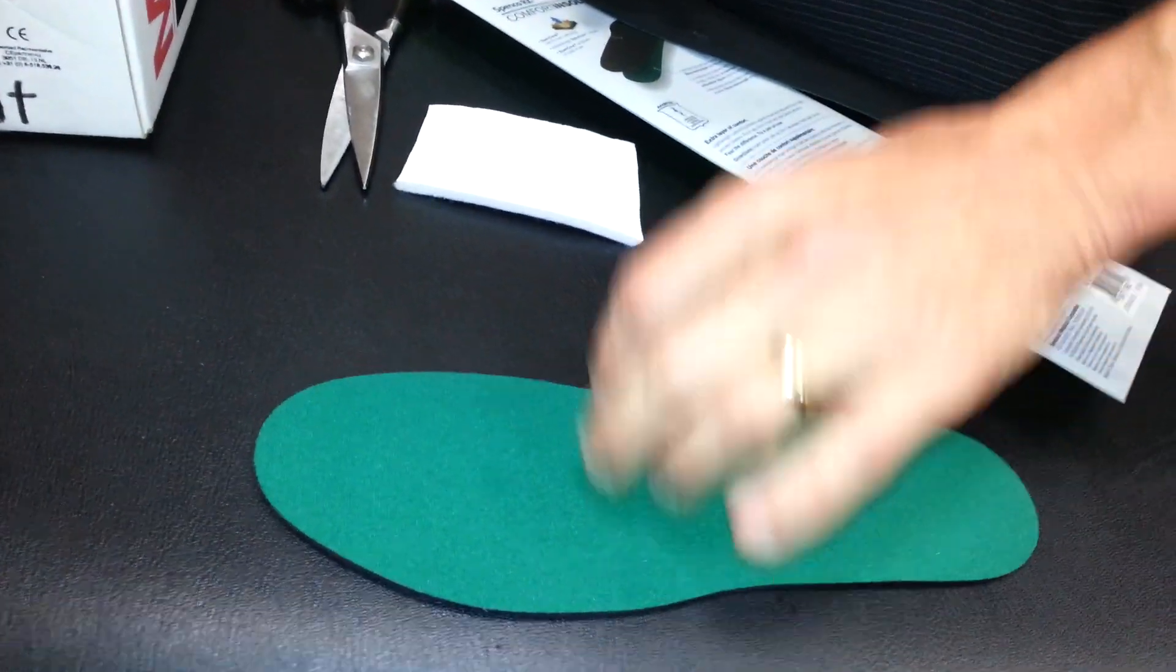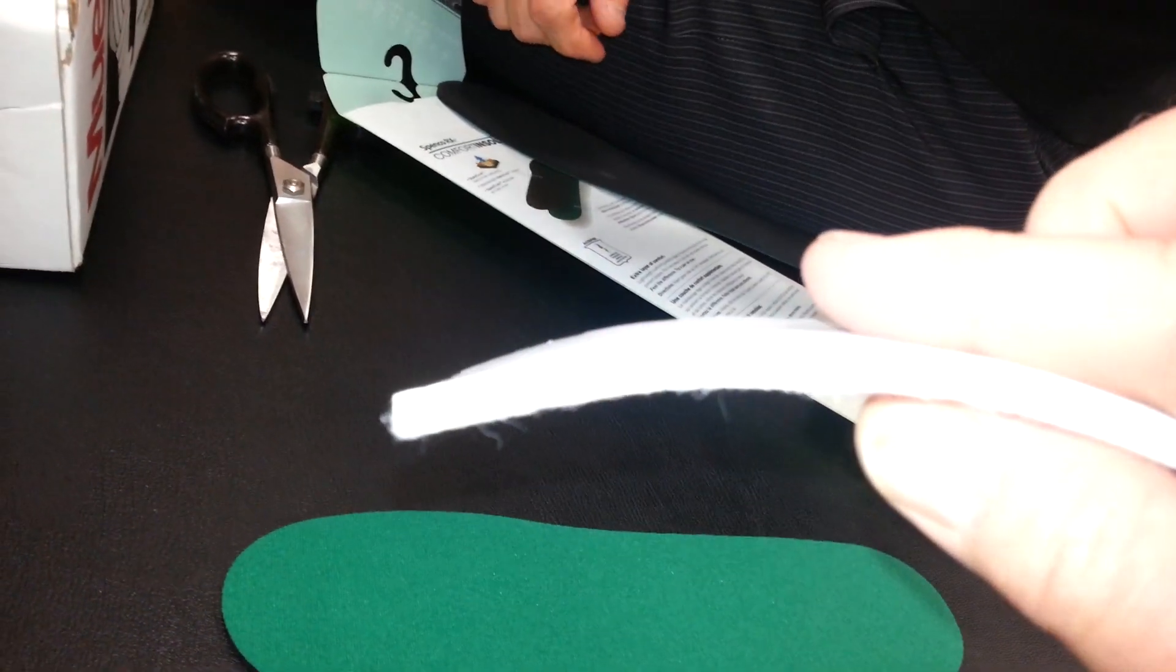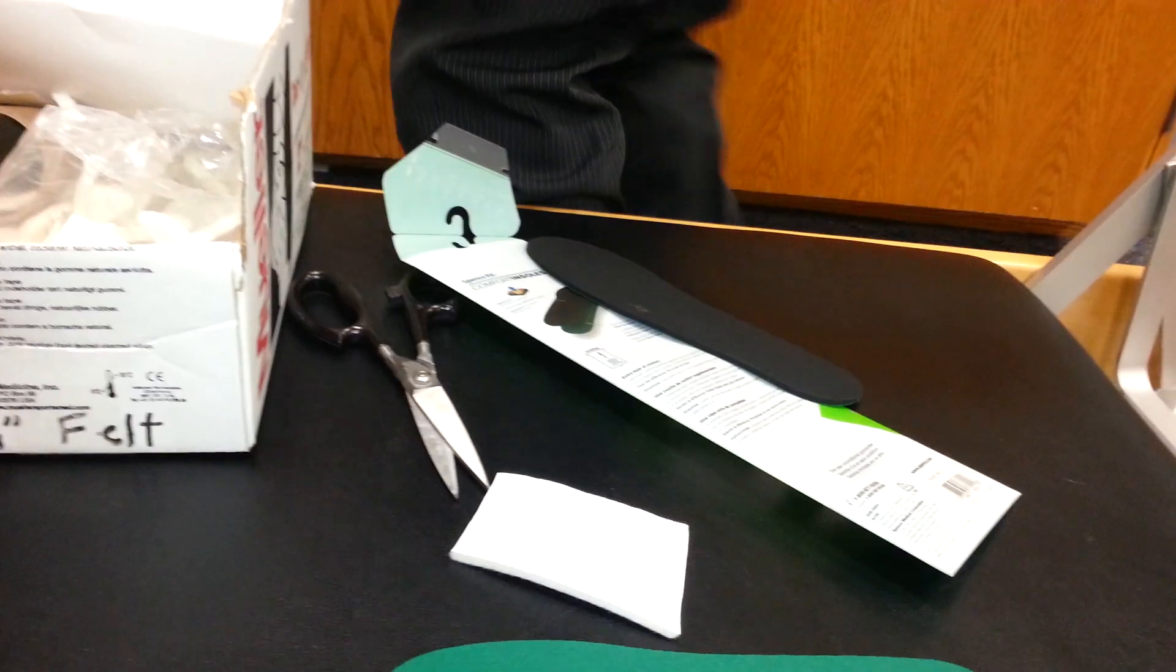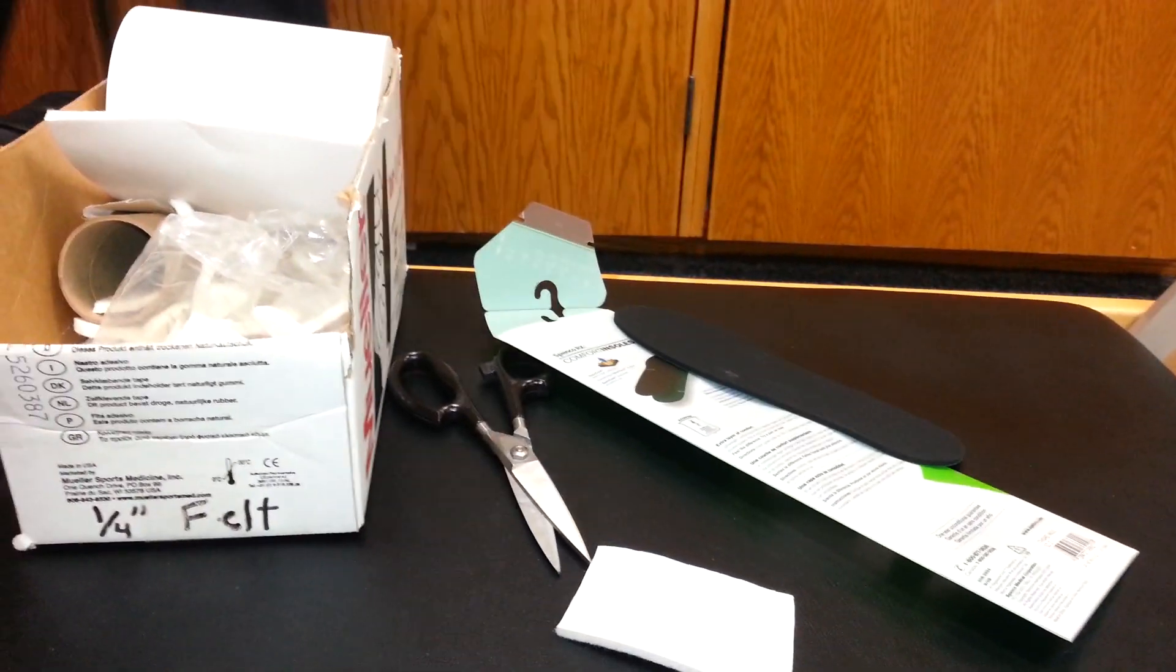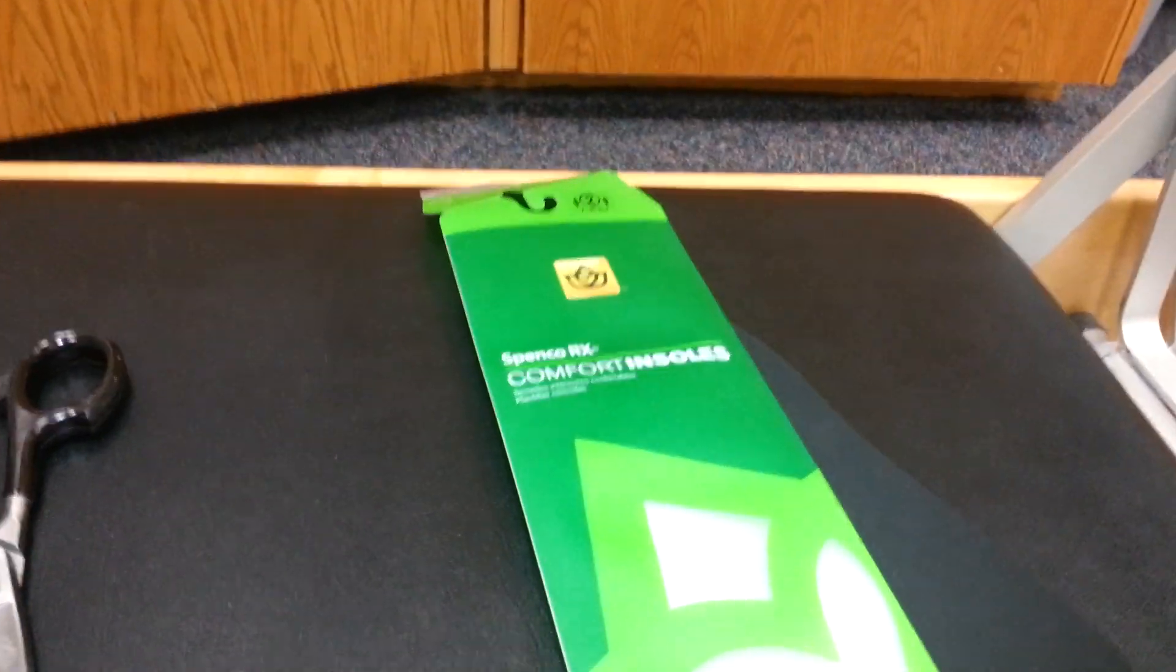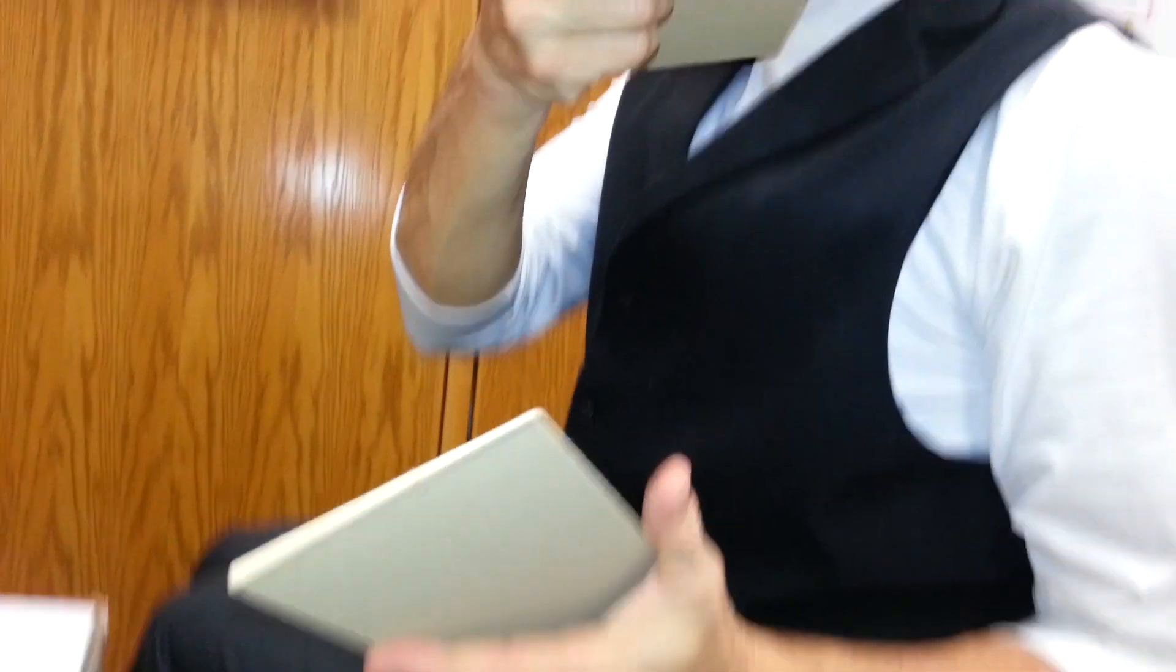So this is quarter-inch felt you're looking at here? Now I'm going to give you one other thing that you may want to try. Okay. And she'll have to have a pair of these. This is cork-posting. What's it called? Cork-posting.